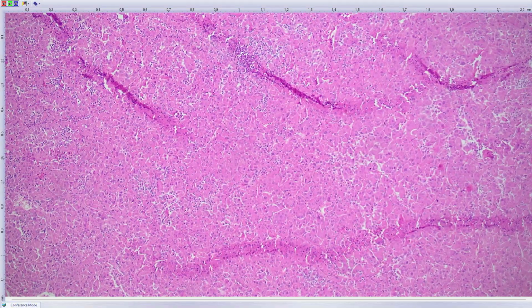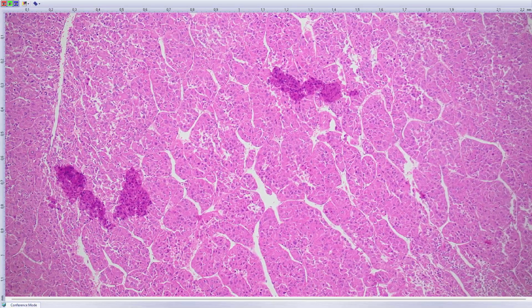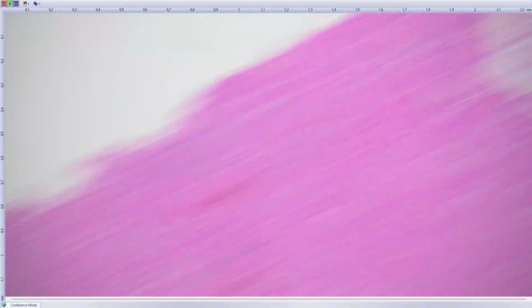And he wanted to see the slides from the first tumor. Basically, you can consider this a form of de-differentiation of GIST caused by the additional TSC1 mutation, which changes the morphology to basically a PEComa-like morphology. So probably it's going to be very unfavorable for the patient, but for us it's a fascinating story.